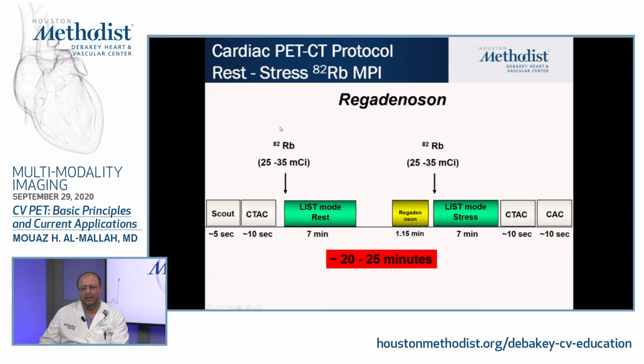We are now injecting, because we have a digital PET scanner, 10 to 20 millicuries, but I put here the doses which are more commonly used in practice using 3D systems, which are the 25 to 35 millicuries on the 3D systems.